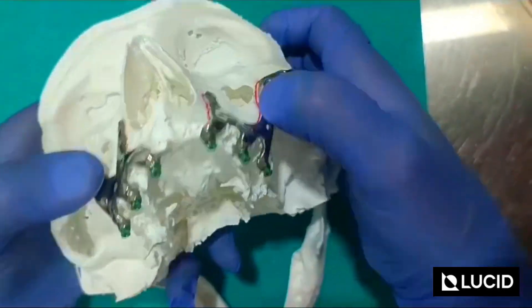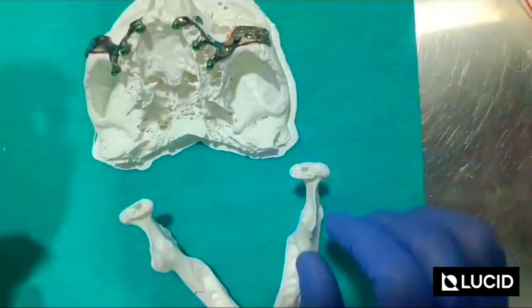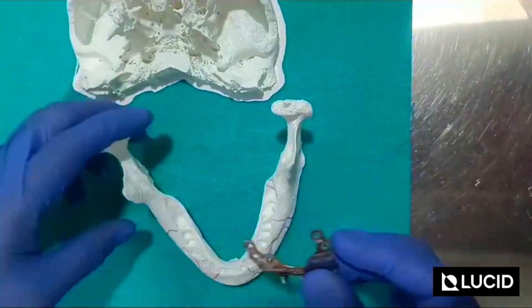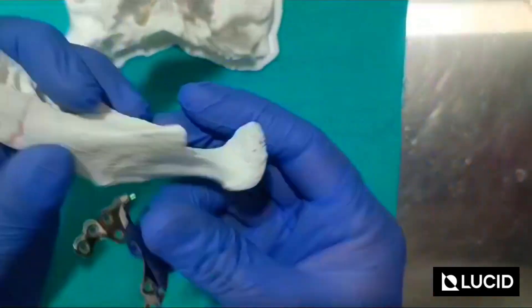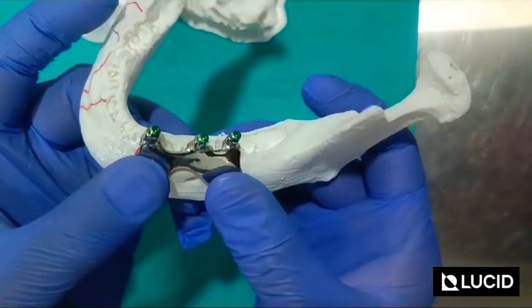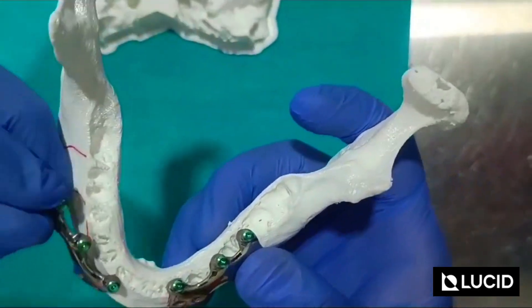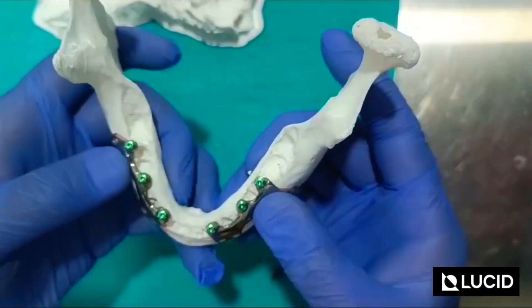The second maxilla implant is placed like this. Now let's work on the mandible. I have done the marking on the mandible as well. This one will be placed on this side — like this. And this one will be on the other side — placed like this.